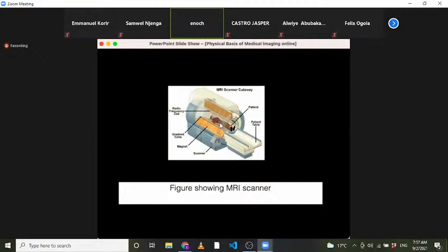Because the signal comes in the form of an RF signal, we can use an antenna or coils, which work on the basis of electromagnetism. Whenever we have a changing magnetic field, it induces current in a coil that is nearby, and whenever we have alternating current flowing in a conductor or a coil, it induces a changing magnetic field.